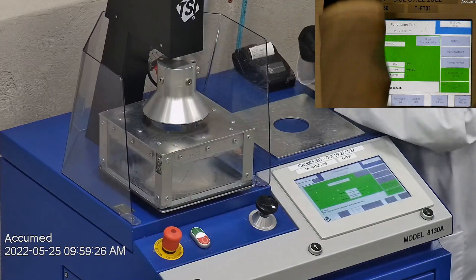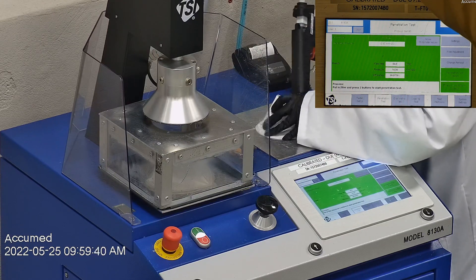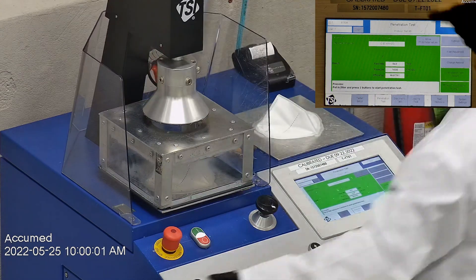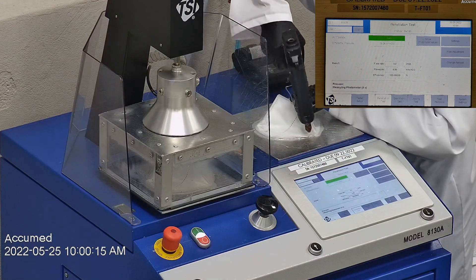F stands for air flow rate, which we test at 85 liters per minute. R is for resistance, also referred to as pressure drop — this correlates with breathability, so the lower the number, the more comfortable and breathable the face mask or respirator is. E stands for filtration efficiency percentage.